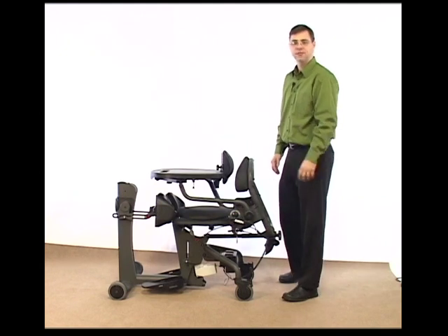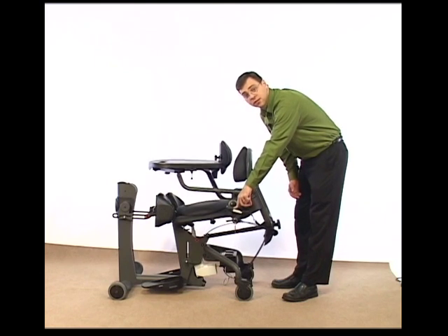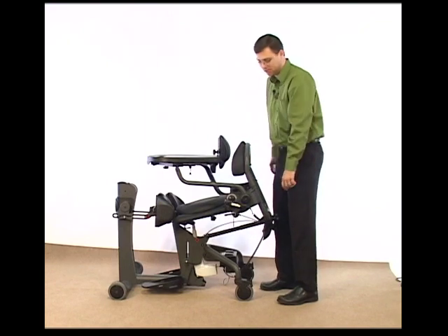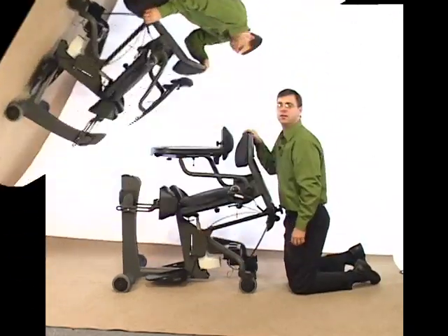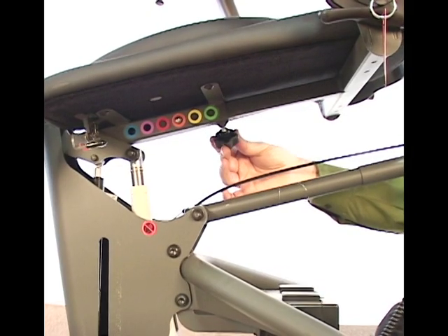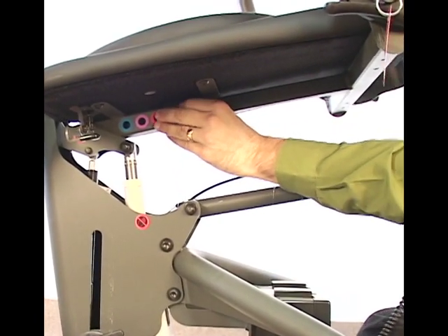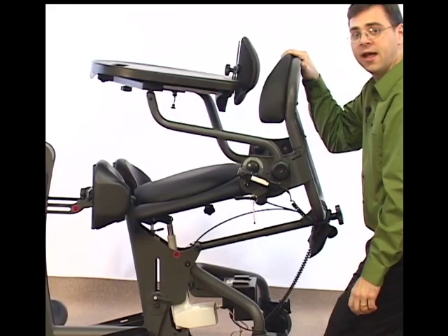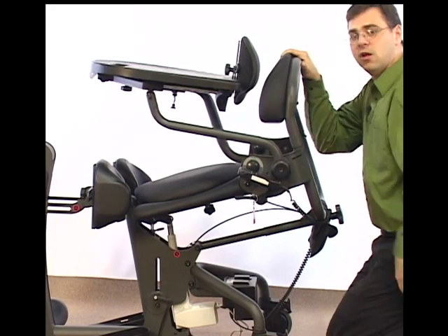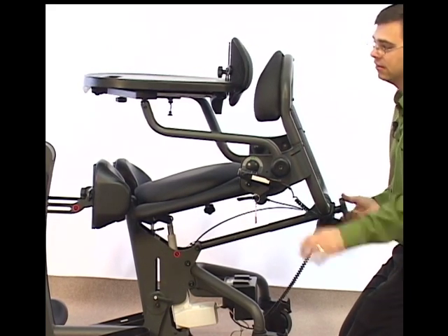Now, what I want to do to make the seat depth a little easier is to elevate the Easy Stand into a slight angle. I'm working with the power lift option here today. If I was using the hydraulic, I'd just give it a couple of pumps until I have an angle just about like this. Next, I come to the seat tube adjustment underneath the middle of the Easy Stand and loosen the knob. Once the knob is loosened, I push the button, follow the arm, and pull the seat depth adjustment back. You'll notice that as I adjust the seat back, the angle of the table also changes. To correct that, I turn the knob at the back of the Easy Stand and that levels the table out again.